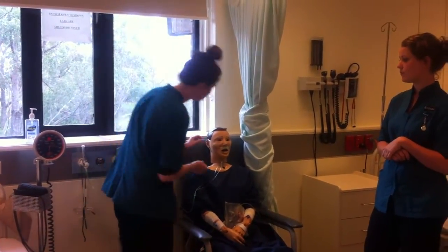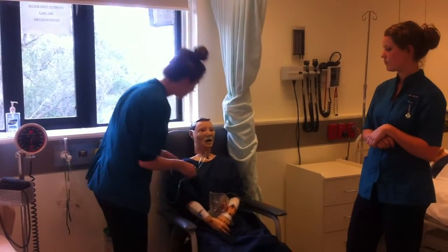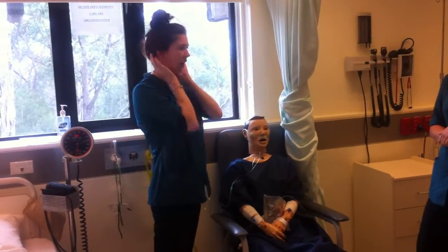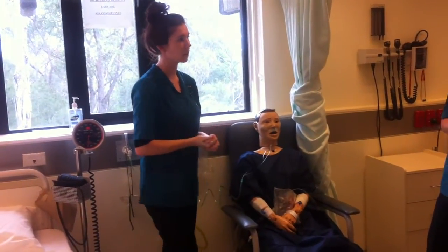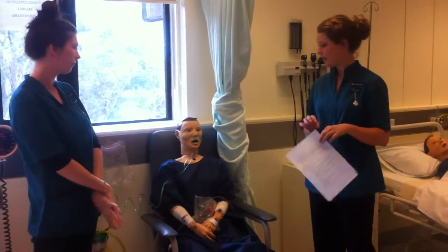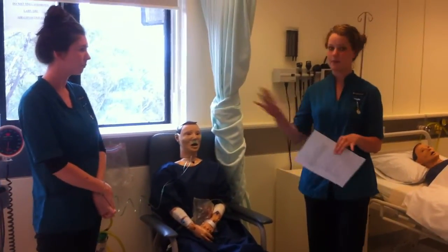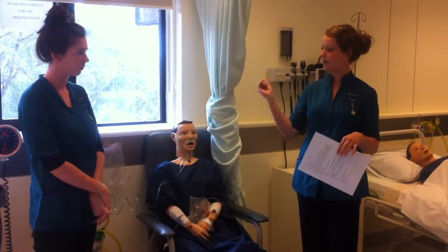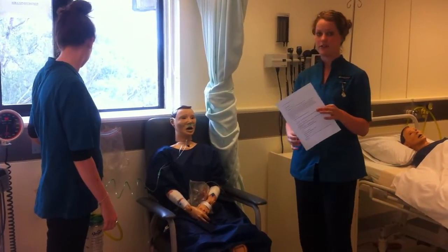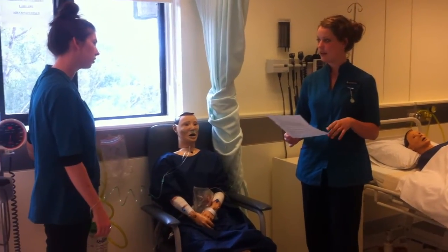So in this, just make sure that he's comfortable, that there are no incrustations, and you can also apply some type of Vaseline for nose and ear care because he's an 81-year-old man. Alright, so then we'll see how he goes with the oxygen. As Penny said, we'll do the trial, so knock the litres down and then see how he goes. Closely monitor his oxygen sats and his respirations. And that's it.